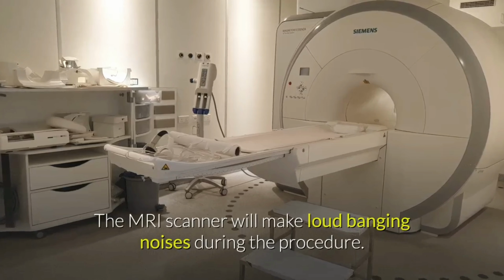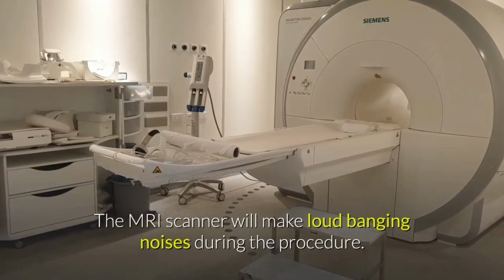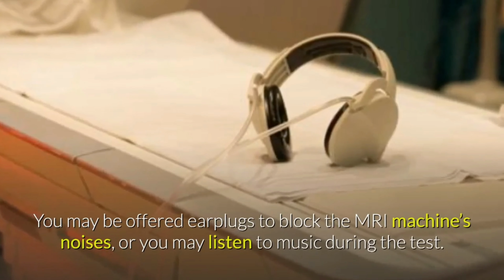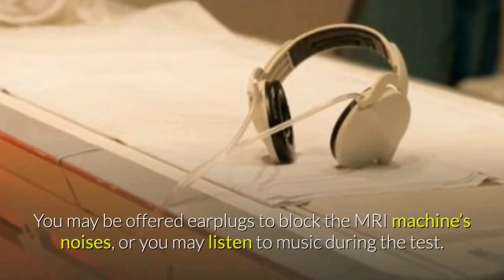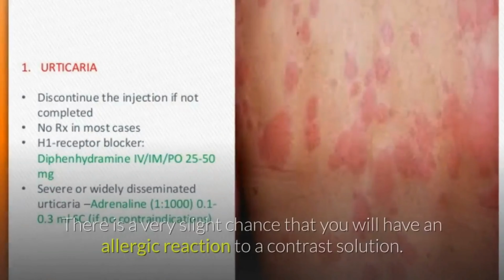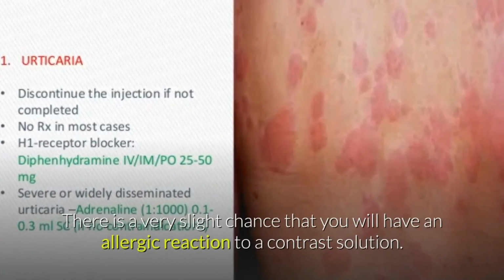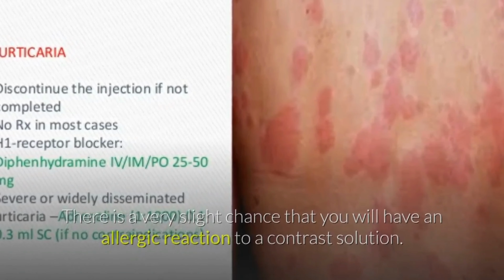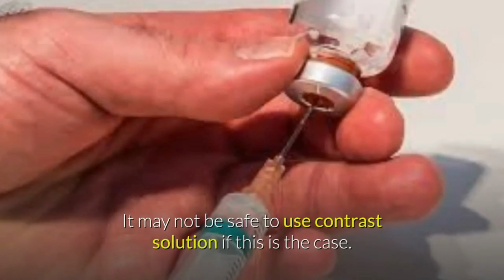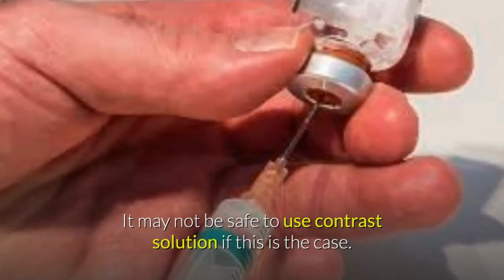The MRI scanner will make loud banging noises during the procedure. You may be offered earplugs to block the MRI machine's noises, or you may listen to music during the test. There are no risks associated with an MRI itself. There is a very slight chance that you will have an allergic reaction to a contrast solution. Tell the medical staff if you have decreased kidney function. It may not be safe to use contrast solution if this is the case.